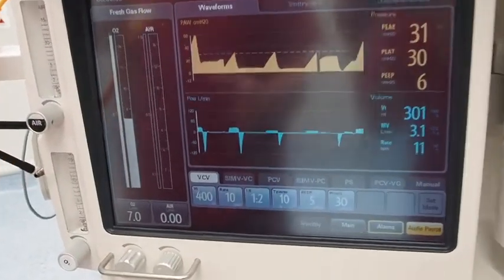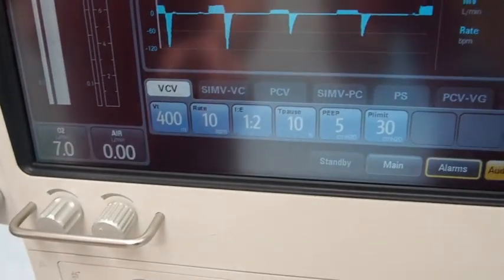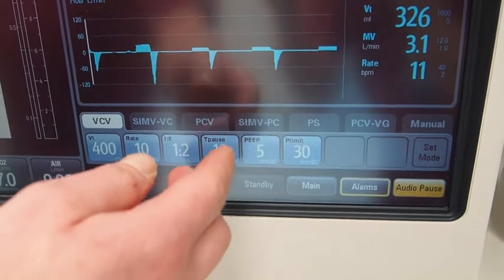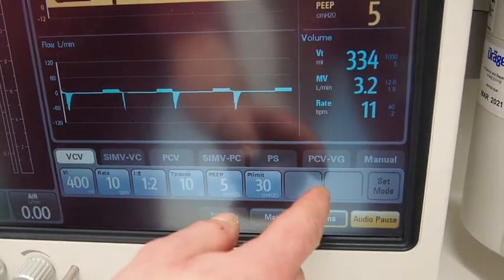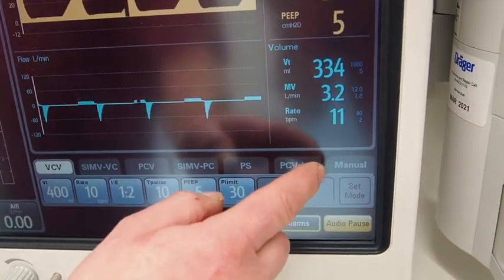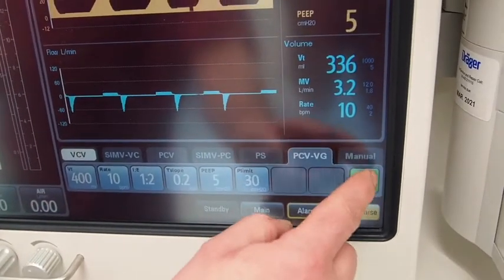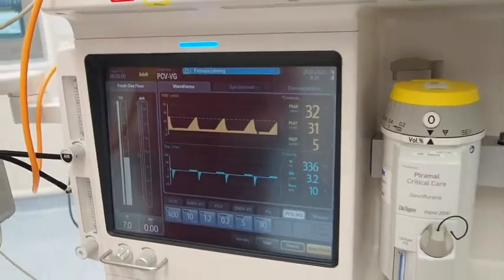It's very, very intuitive. You've got all the usual different modes that you would like to see on an ICU ventilator. You've got SIMV volume control, pressure control ventilation, SIMV pressure control, pressure support, and PCV-VG is very much like PRVC, and that would be our standard mode that we use by default. So you hit that, check your numbers here, press set mode. And we're going to be ventilating around 6 mils per kilo as we do any other patient.